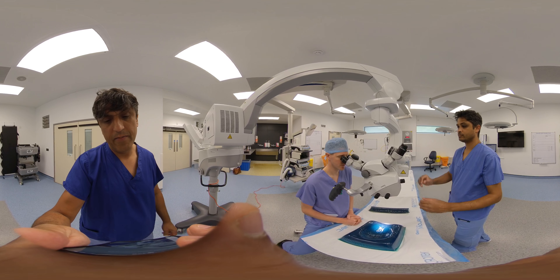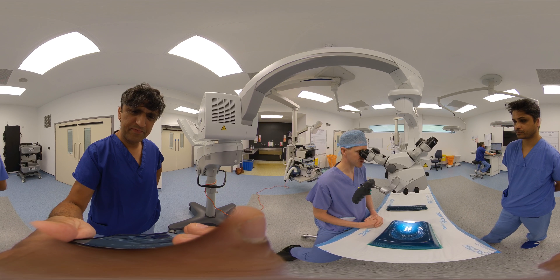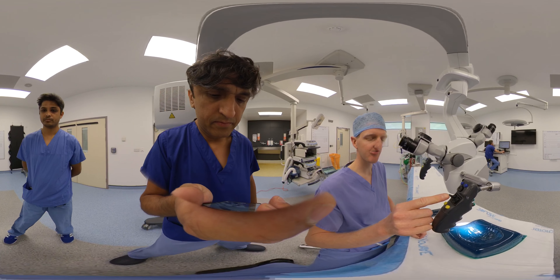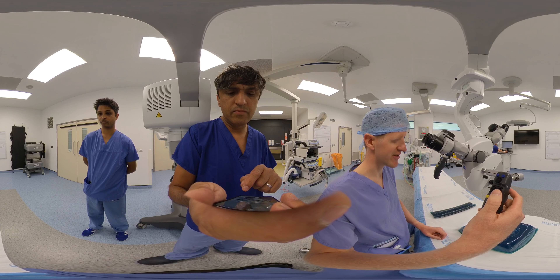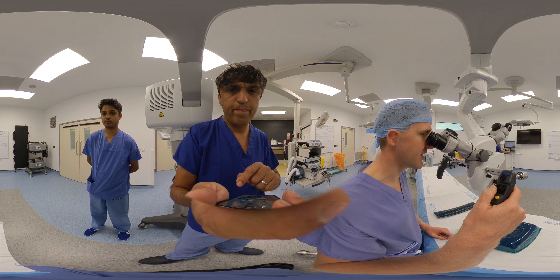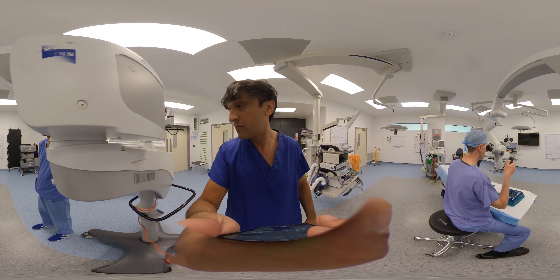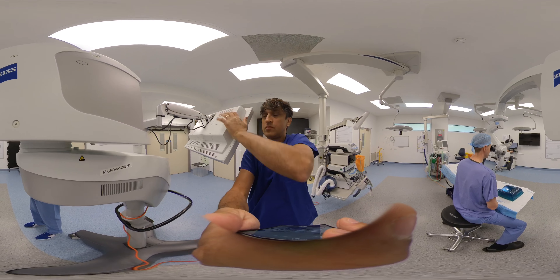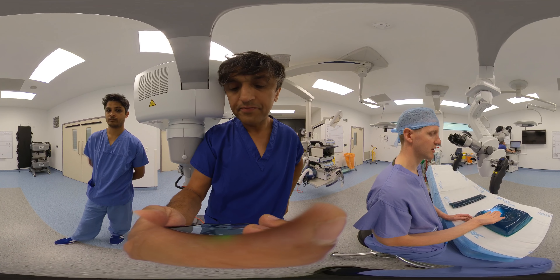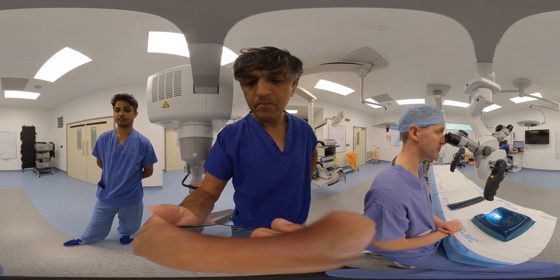In terms of depth of field and focus: once you've decided where you're operating, you want to make sure you're focusing on the target. You come to the handset — which varies from scope to scope — and use a focus dial and a zoom dial. The best way to get focused is to zoom all the way in to the target you're planning to operate on, get your focus right for that target, and then as you zoom out it will remain in focus. The depth at which you remain in focus actually increases as your zoom reduces, giving you more flexibility when manipulating your vessel.